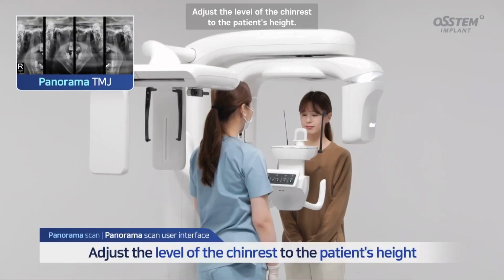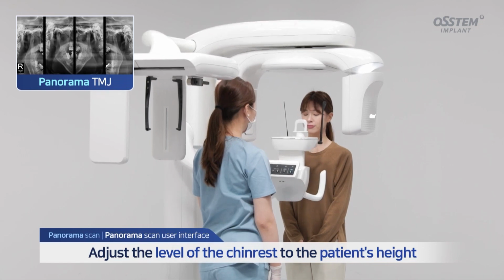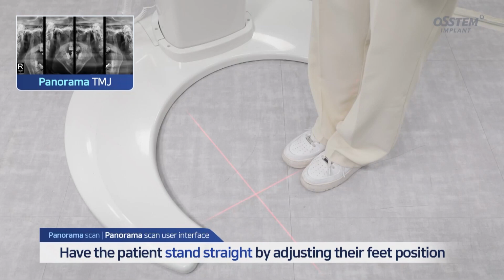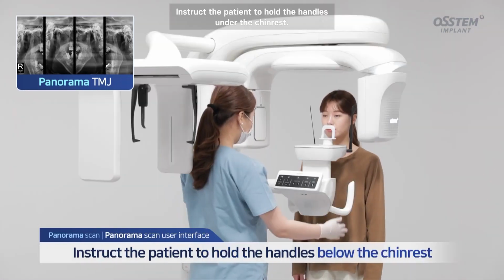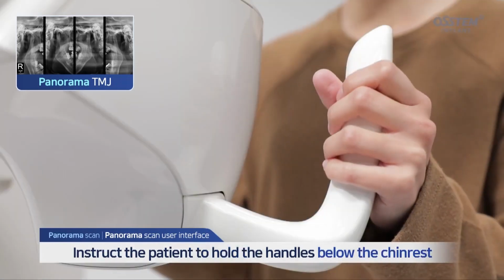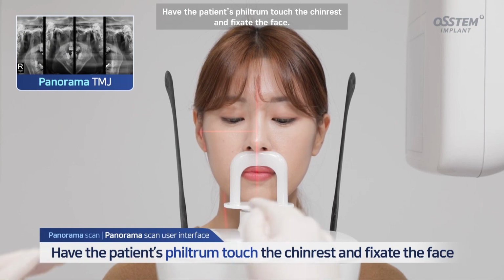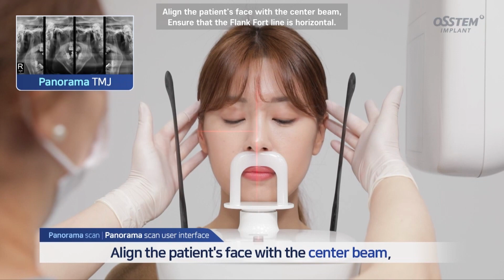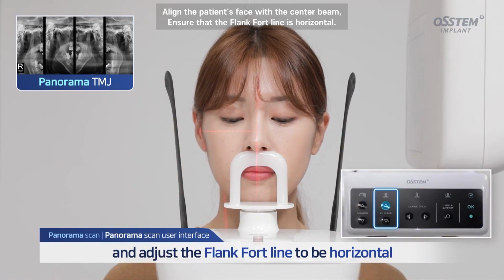Adjust the level of the chin rest to the patient's height. Have the patient stand straight, with their feet in a comfortable position. Instruct the patient to hold the handles under the chin rest. Have the patient's philtrum touch the chin rest and fixate the face. Align the patient's face with the center beam. Ensure that the Frankfort line is horizontal.